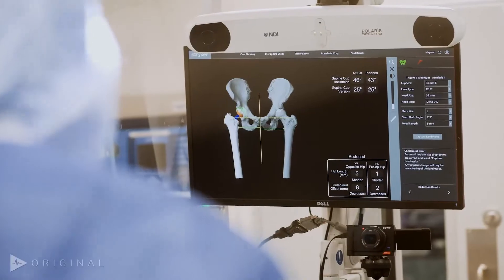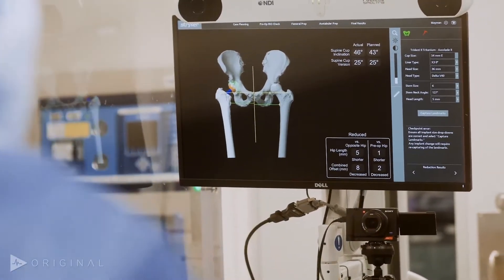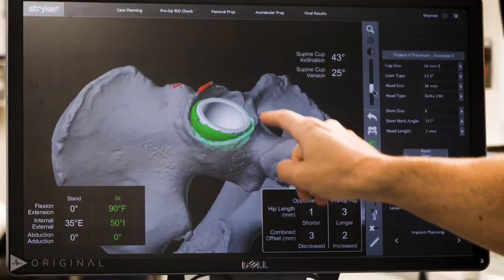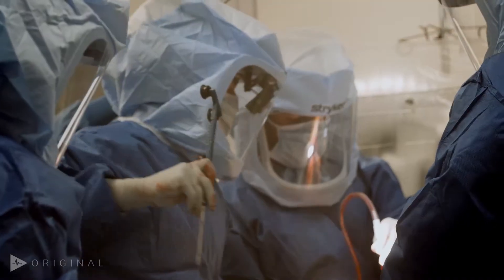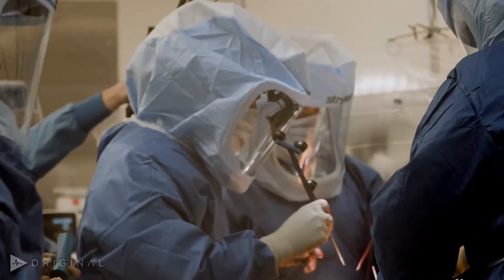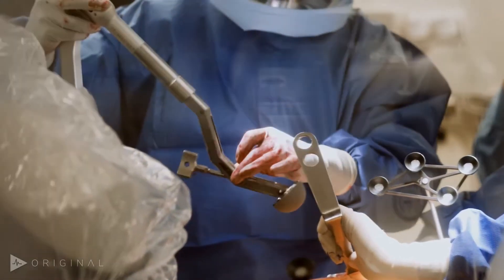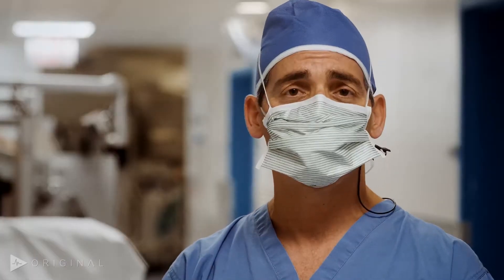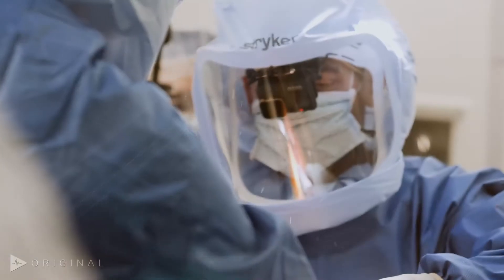We're going to be trying to emphasize the preoperative planning both on x-ray and CT, showing you some of the features of the new software looking at impingement modeling and how we adjust our implant positions in order to avoid impingement and optimize stability of the hip joint.